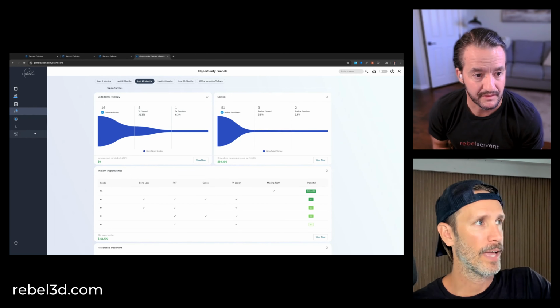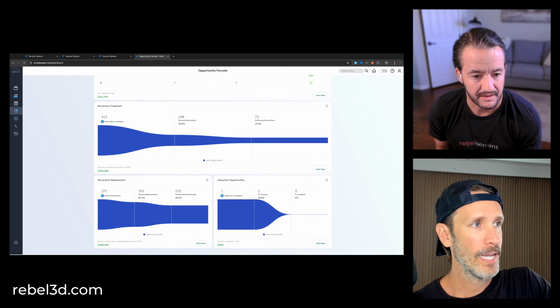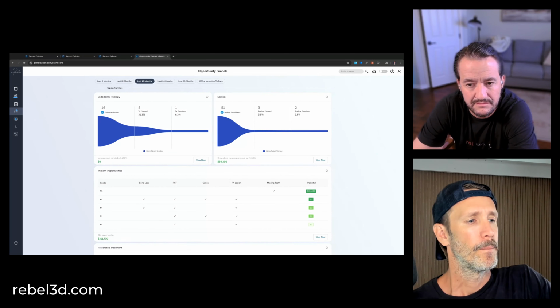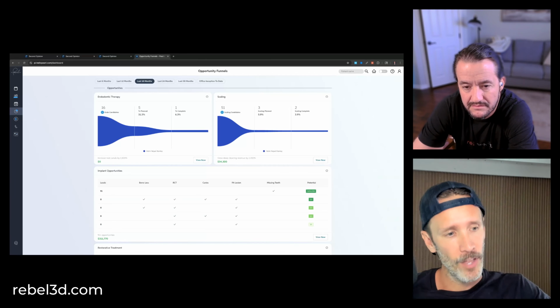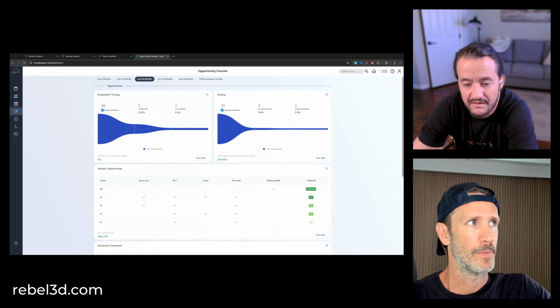This is something that we could never do before AI, is look at opportunity funnels. So if I came to someone and said, you know, have you ever thought about bringing a specialist into your practice? And they're like, oh, yeah, I have thought about that, but I just don't know if I have enough patients that would really fill their schedule. And you could look at that.